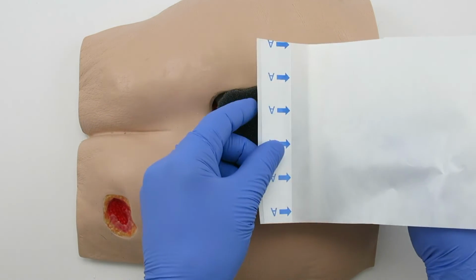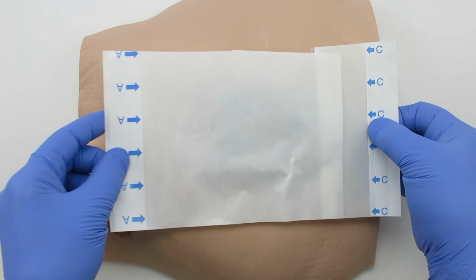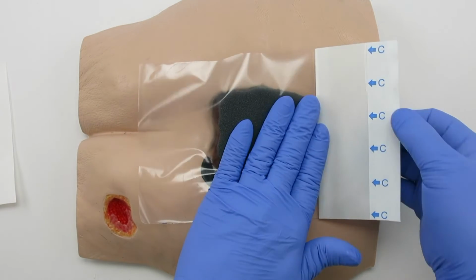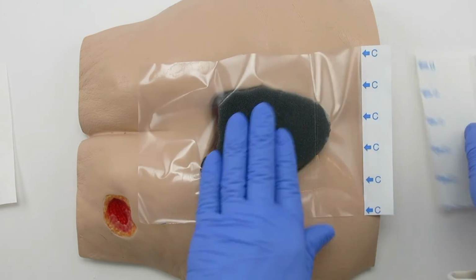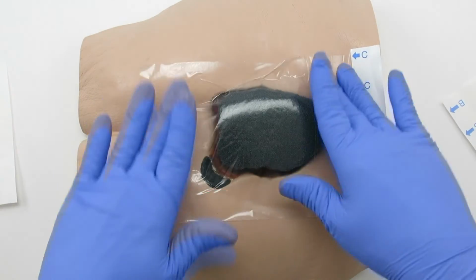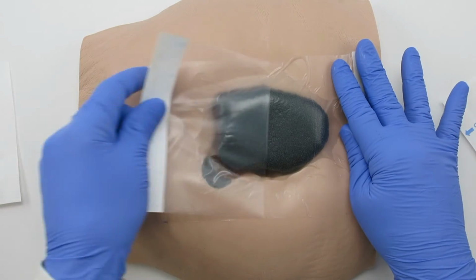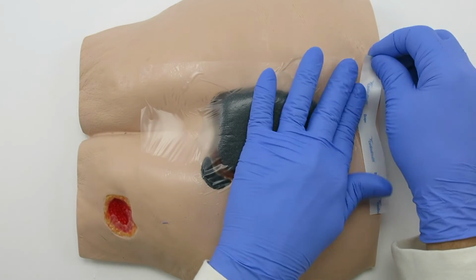The drape should extend about 1.5 inches past the wound margins. To apply the drape, remove the A layer to expose the adhesive. Lay the drape down and smooth wrinkles. Next, remove the B layer, either from the folded end or from the labeled end. Separate the 2 white tabs to pull away the C static layer, leaving the draped wound behind. Finally, tear away the perforated tab.